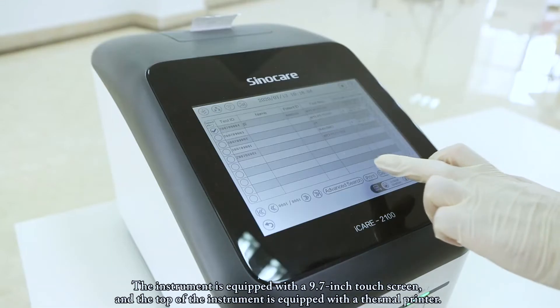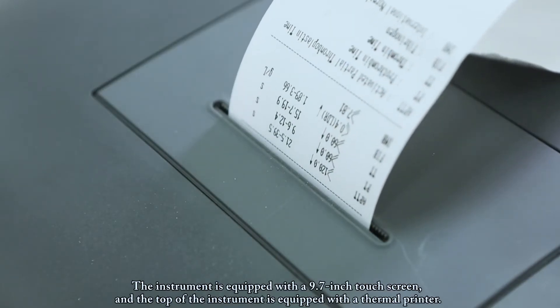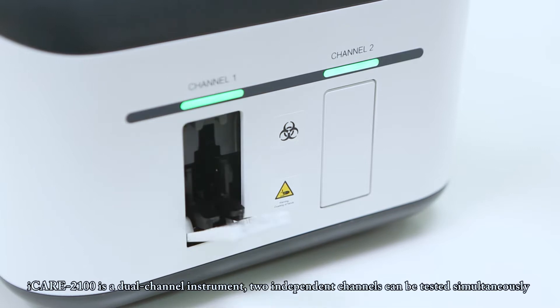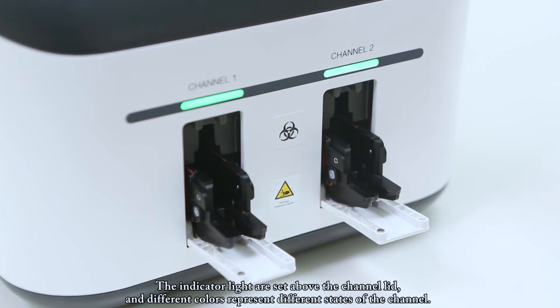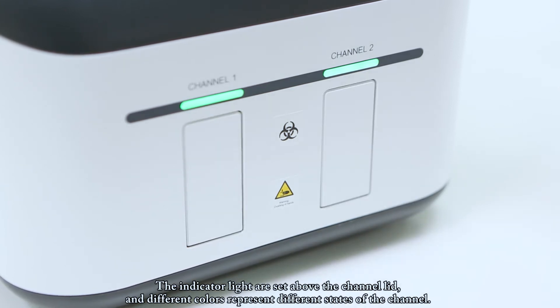The instrument is equipped with a 9.7-inch touchscreen, and the top of the instrument is equipped with a thermal printer. iCare2100 is a dual-channel instrument — two independent channels can be tested simultaneously. Indicator lights are set above the channel lid, and different colors represent different states of the channel.